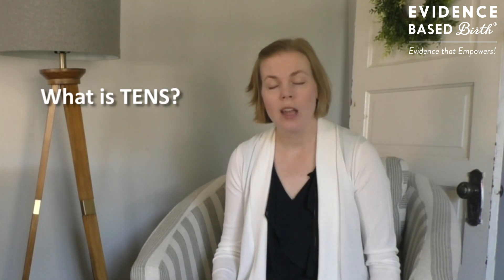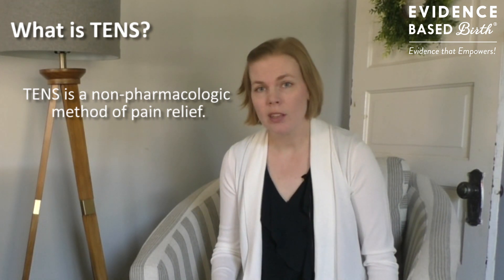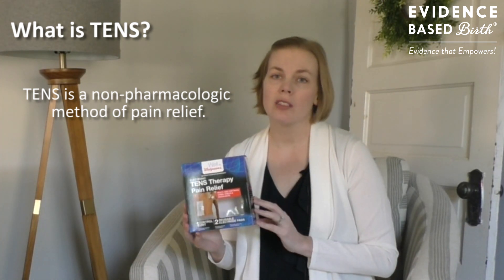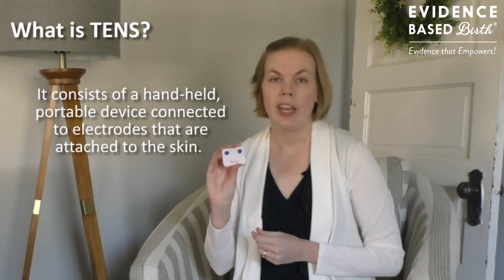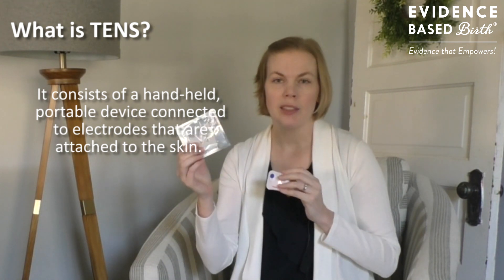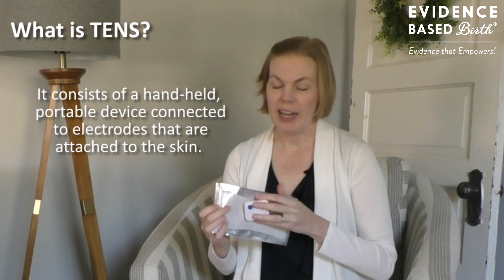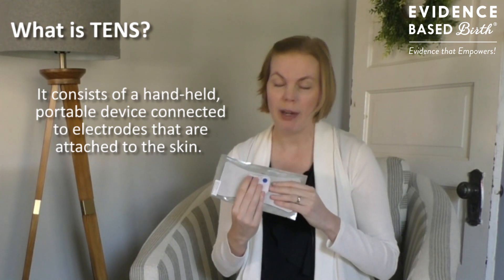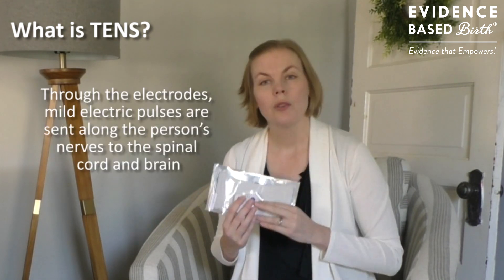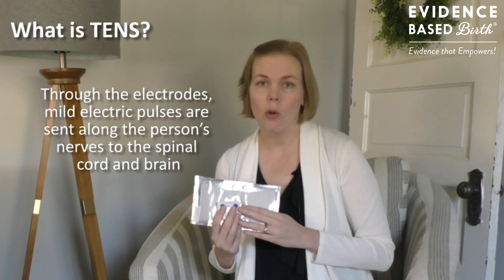So what is TENS? TENS is a non-drug or non-pharmacological way to help manage pain. You can buy TENS units online or at a local drugstore. I picked this one up from the Walgreens down the street from me and it costs about $30. TENS consists of a handheld portable device connected to electrodes, which typically come on pads — a small pad and a larger pad — and you would connect the unit to those electrodes either directly or sometimes by wires. You would then place these pads on the body, and through the electrodes, mild electric pulses are sent through the skin and body to the person's spinal cord and brain.